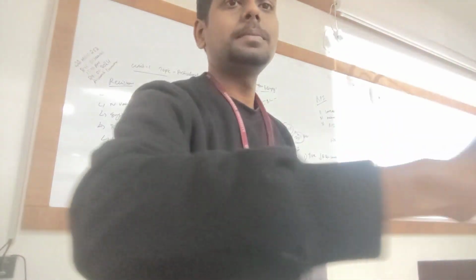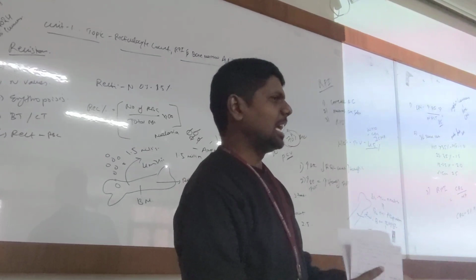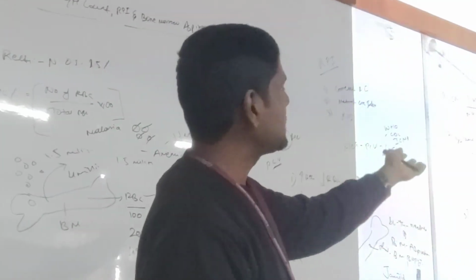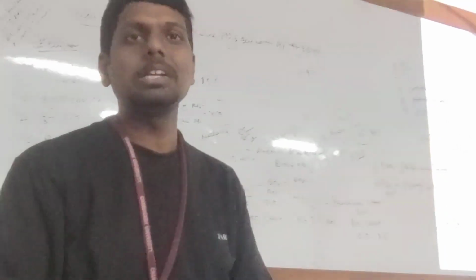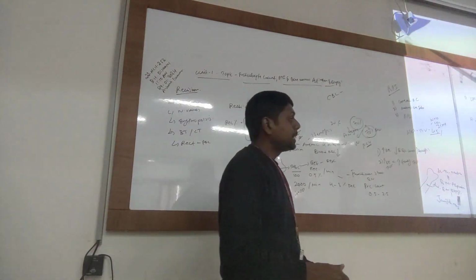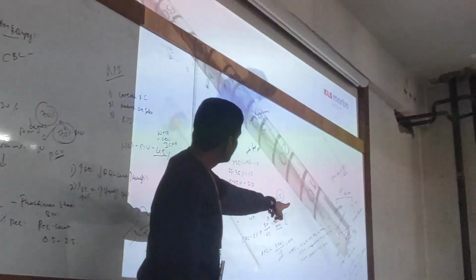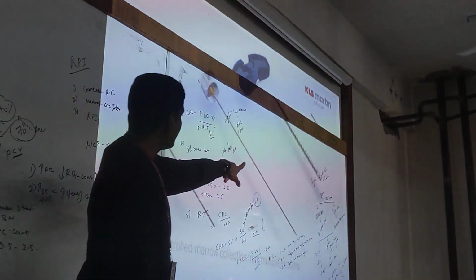Oh, we don't require sound actually. So this is a modified Jamshidi needle. They said they have some elongation. Okay, this is a new company. They are doing these things. So this is a modified Jamshidi needle. Take a Jamshidi needle, and it has a drill bit. It has two portions. You can see here.